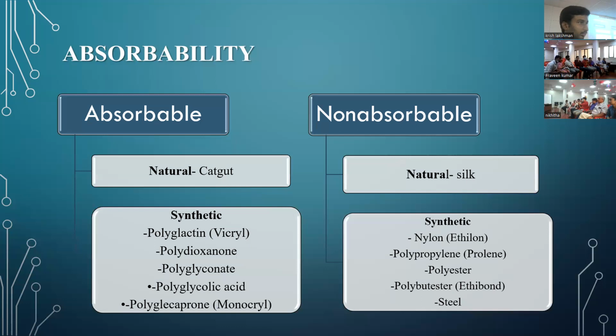So now he told me about absorbable versus non-absorbable. Where will you use non-absorbable sutures? Skin closure. Okay, fine, skin closure. Why do you use non-absorbable skin closure and not absorbable? No, let's just keep it simple. In laparotomy, why do we use non-absorbable versus absorbable in a primary wound closure?